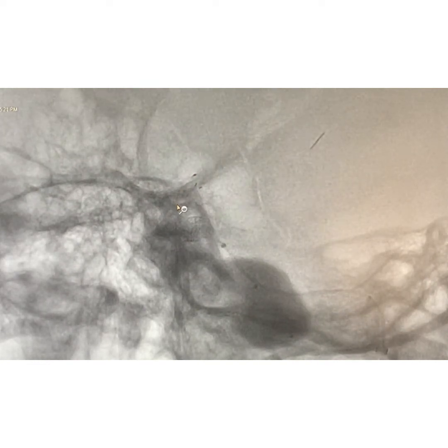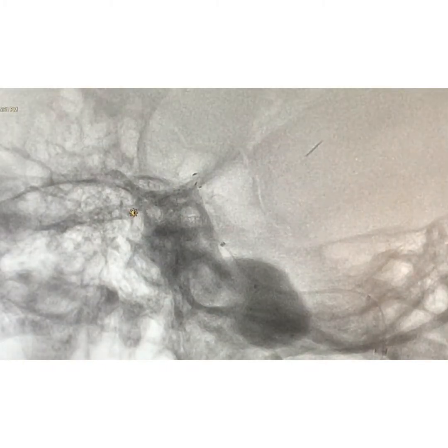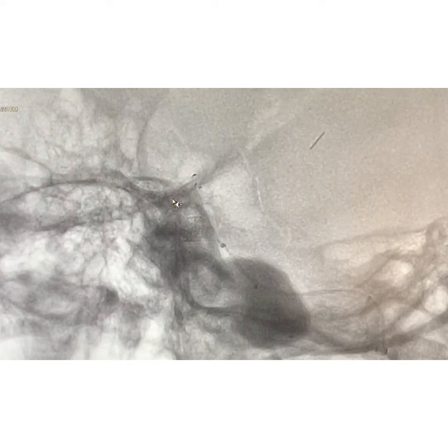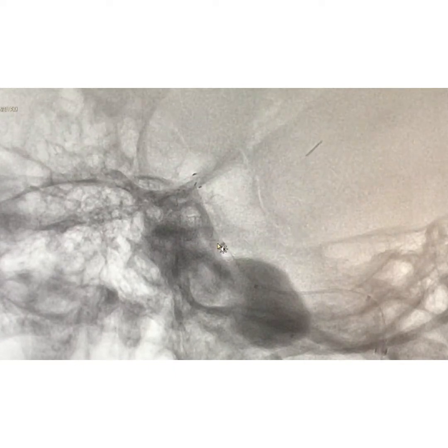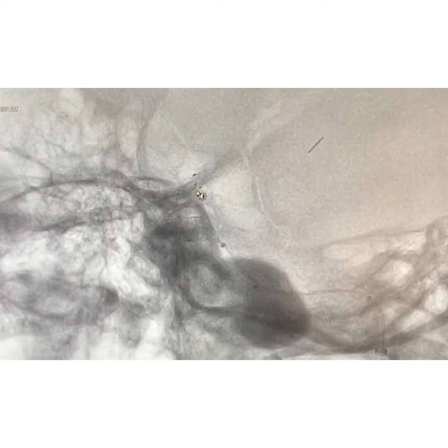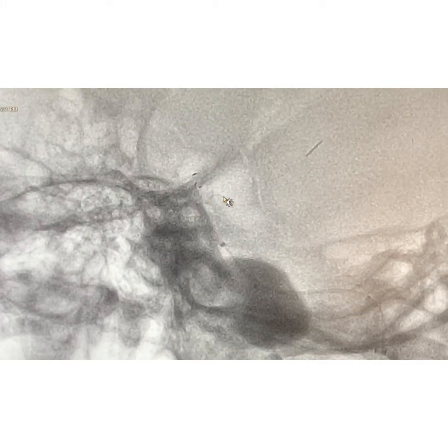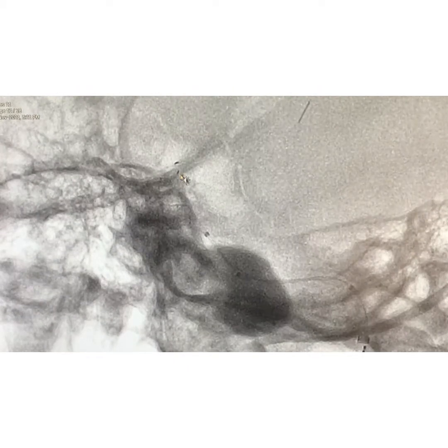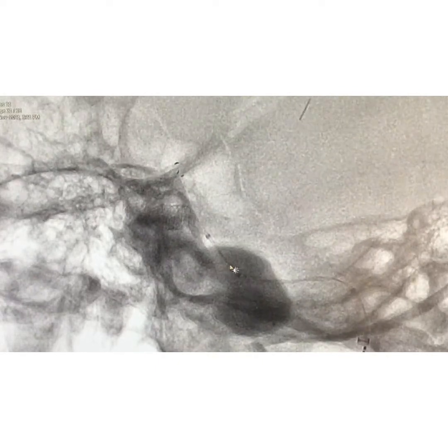ICA, and as we see here, we can see the distal marker of the flow diverter, and as we keep pushing the flow diverter out of the microcatheter, that's the way to deploy. You just have to push the stent or the flow diverter out of the microcatheter, and it'll just get deployed across the vessel that you want. So we can see now the flow diverter is deploying into the cavernous segment.